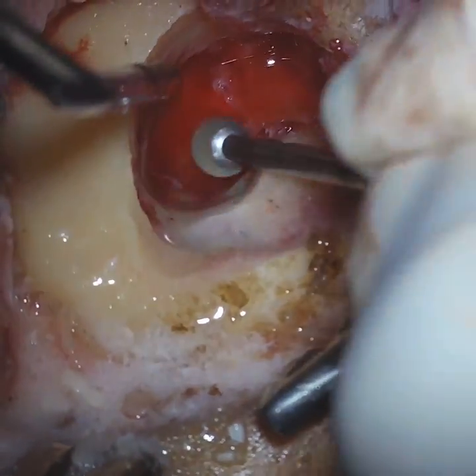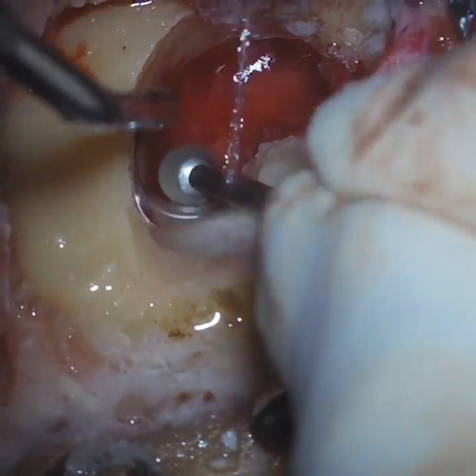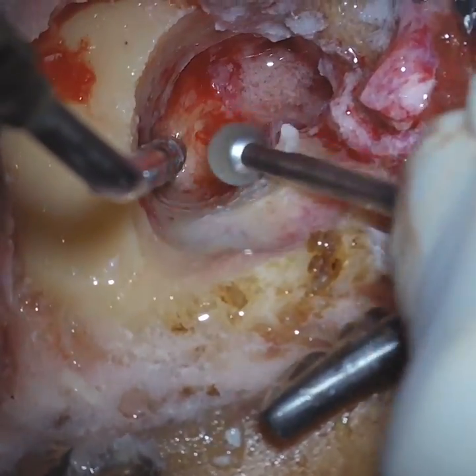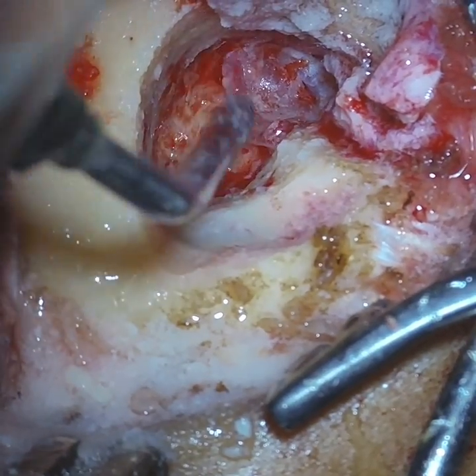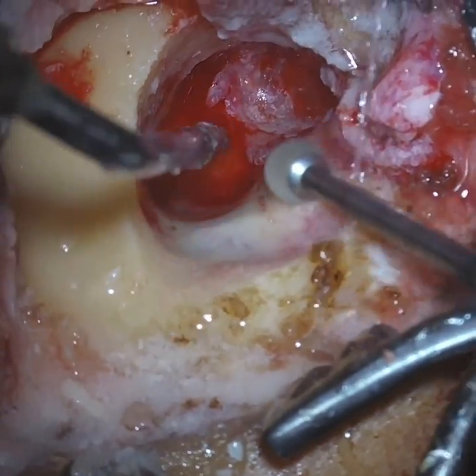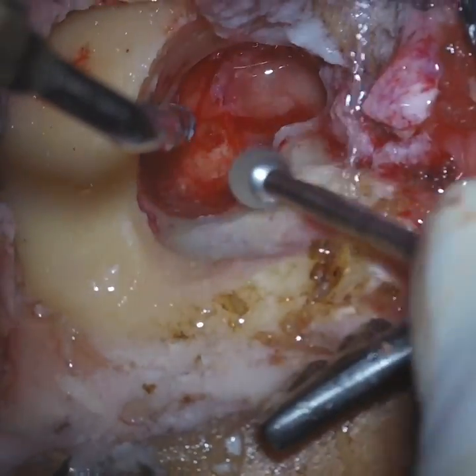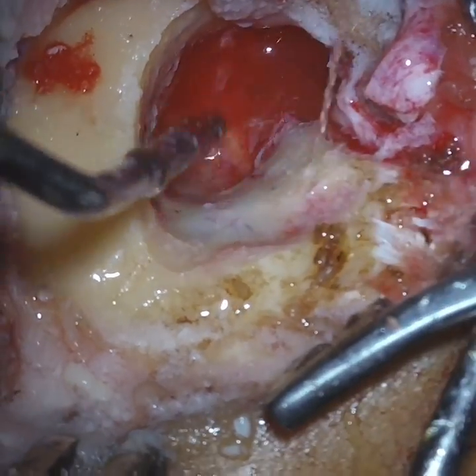So now here you are seeing, the mastoid cavity is not a very big cavity, so we have to slowly make the boundaries, and then it is very important to make a good extraction here. For that we need to fully expose the facial nerve, and our concept is that if you fully expose the facial nerve in such extensive disease like this, you have a good chance to expose the sinus tympani area, and then all the disease from the facial recess area and around the window area and sinus tympani and all the hidden areas can be easily seen.